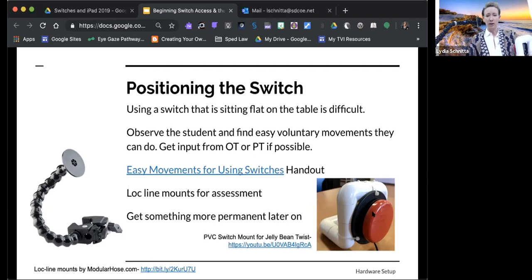for support or use their armchair rest, so they don't have to fight to get back off of the button. I think that's the biggest challenge: the student might get worked up and get on the button, and then they're unable to get off of it again. So this gives them a little more control. I'm trying to show you on my little screen, but just being able to move in one direction, forward and backwards, is a lot easier. So even just things like that.